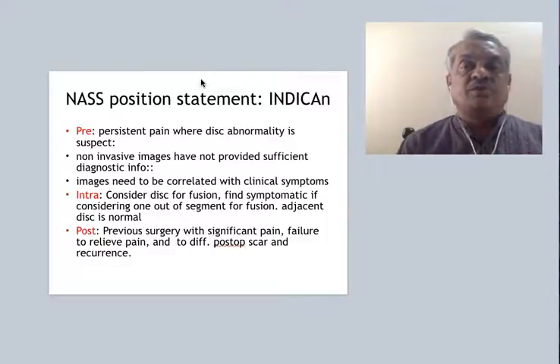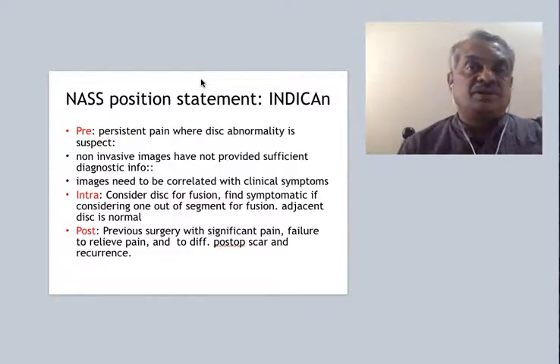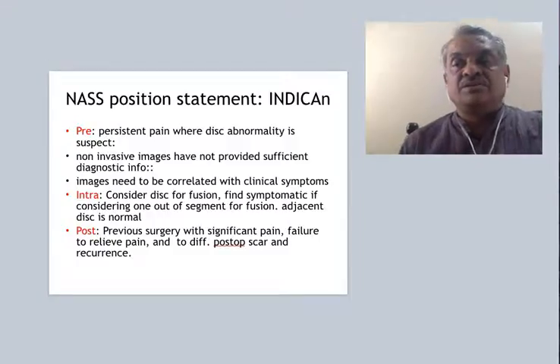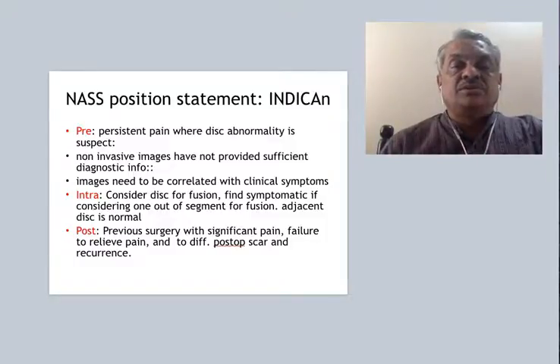In case of post-operative status, if the previous surgery has not given significant relief of pain, there is a failure to relieve the pain, and to differentiate between the recurrence of the disc herniation and a post-op scar, a discography may be done. These are the indications which are supported by the North American Spine Society as a policy statement, and these are helpful in understanding the utility of the discography.